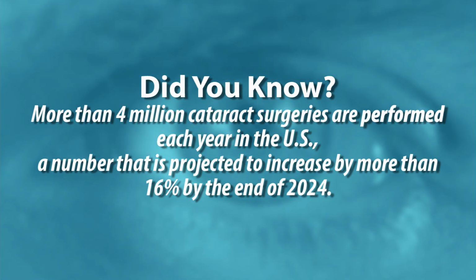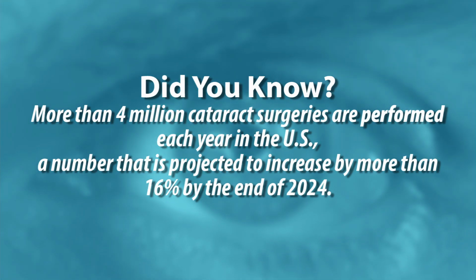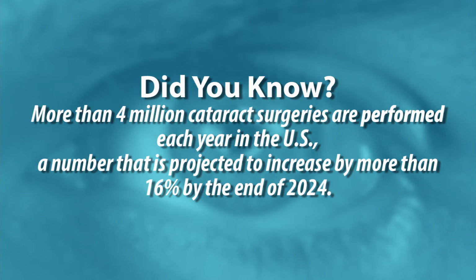And that will provide them not only the distance, but now with a lens like the PanOptix, a full range of vision, which LASIK cannot do. And so now you've got a patient who has been able to get out of eyeglasses for virtually all tasks, and will never develop a cataract later on. And so it goes against the notion that a cataract has to be ripe. In fact, you can take out any lens.